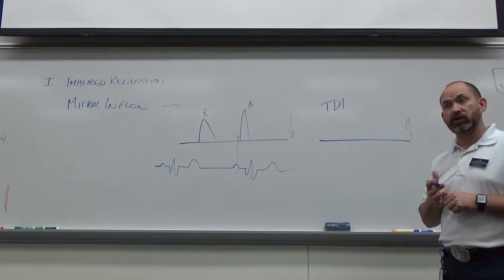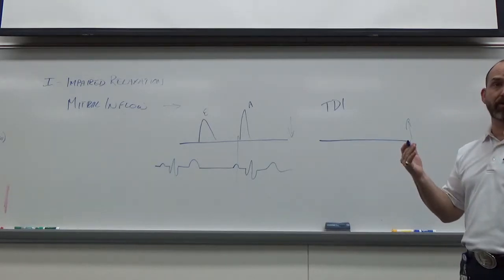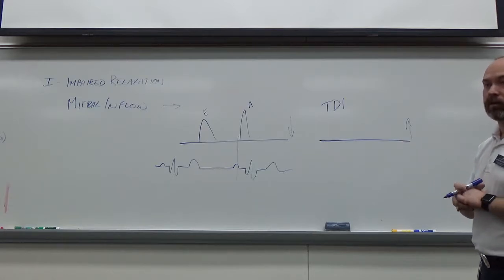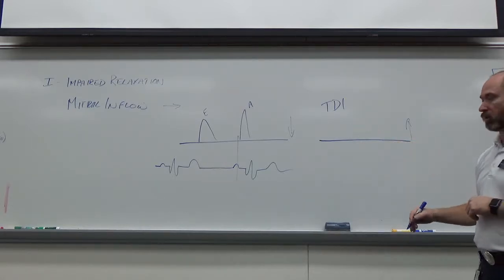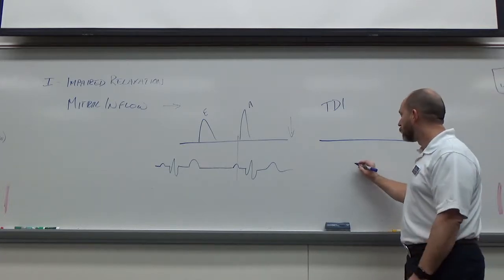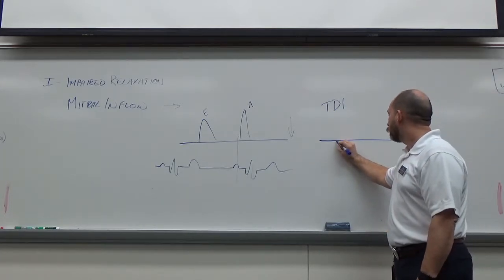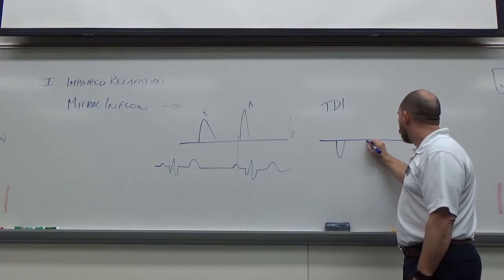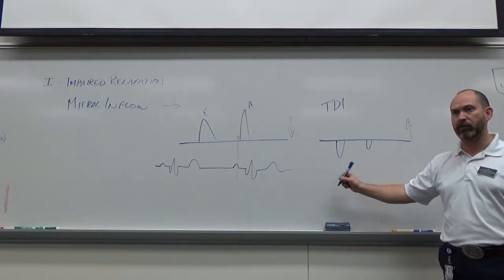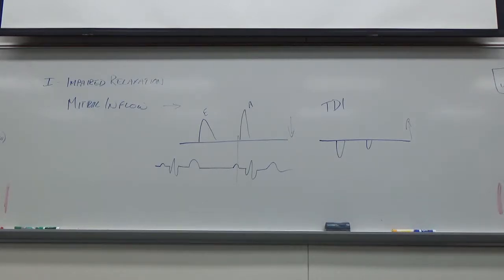It's going to be much lower. Our velocity is going to be around 10. On a normal individual we could be up to 20 centimeters per second, so a lot slower than this. My scale should be probably down around 40 centimeters per second, just as a gauge. Normal should look like this, with a taller E wave, a higher velocity E wave, than the A wave.